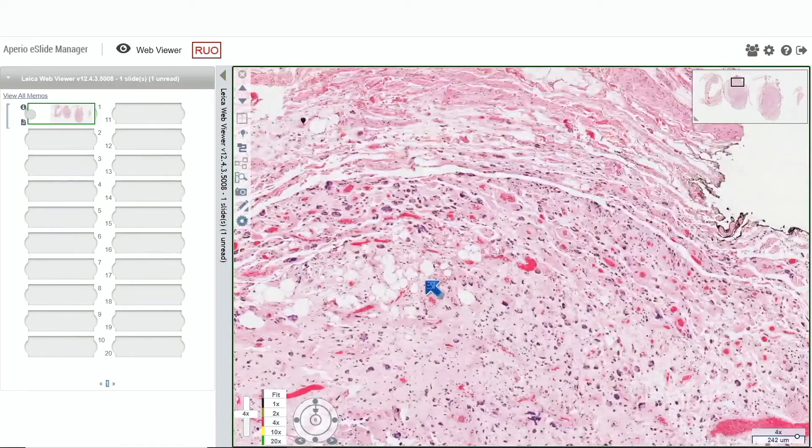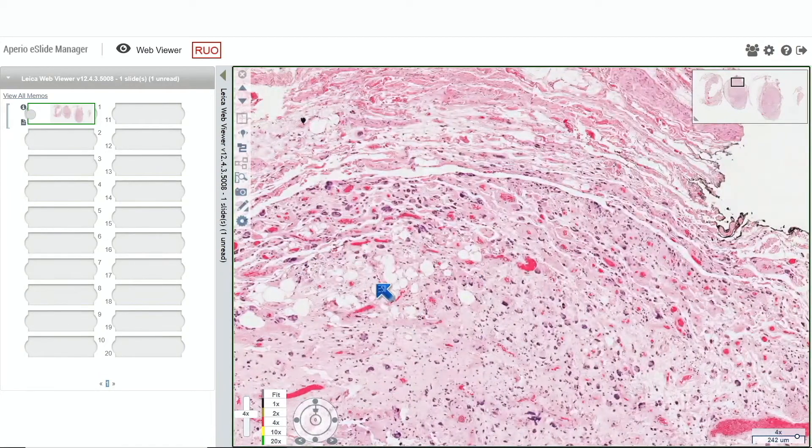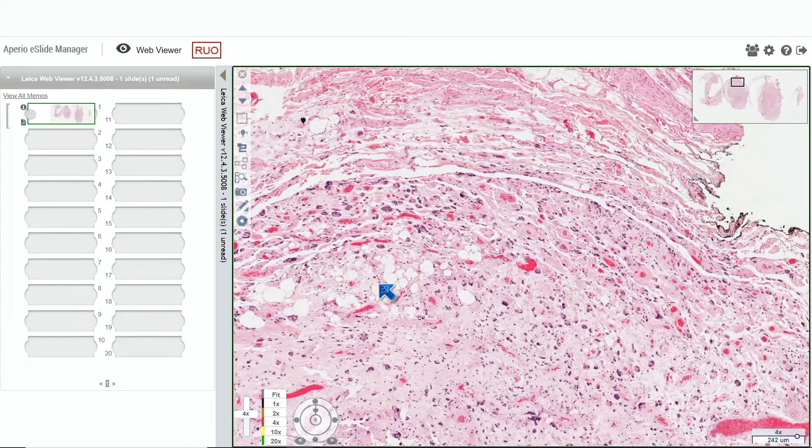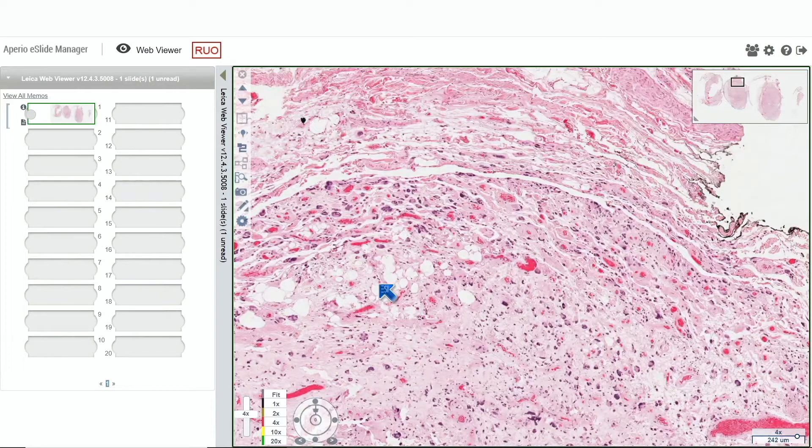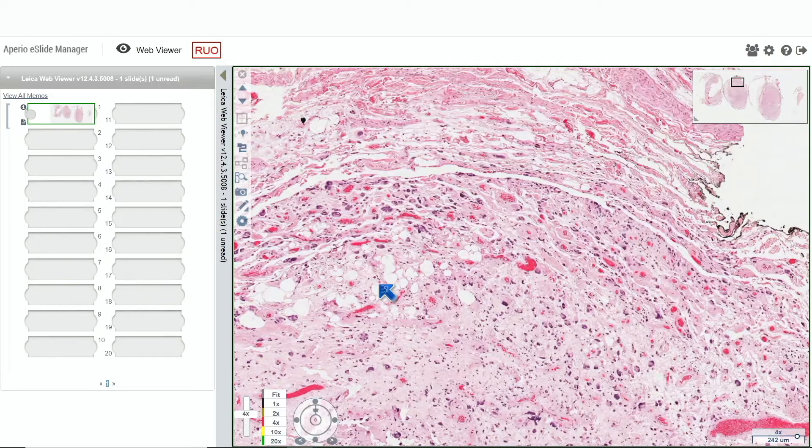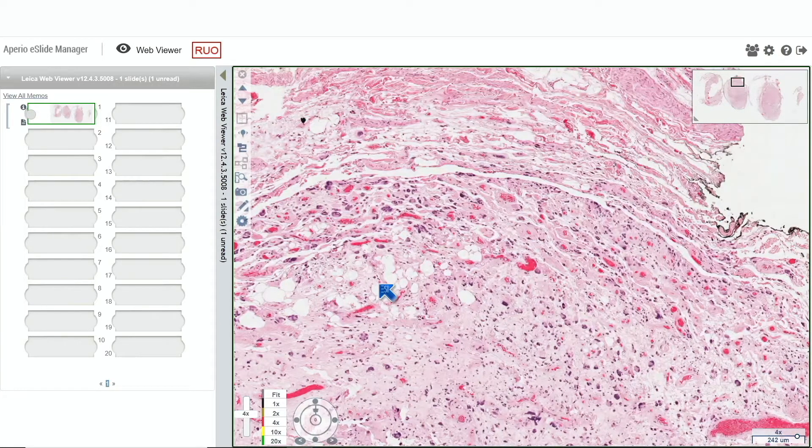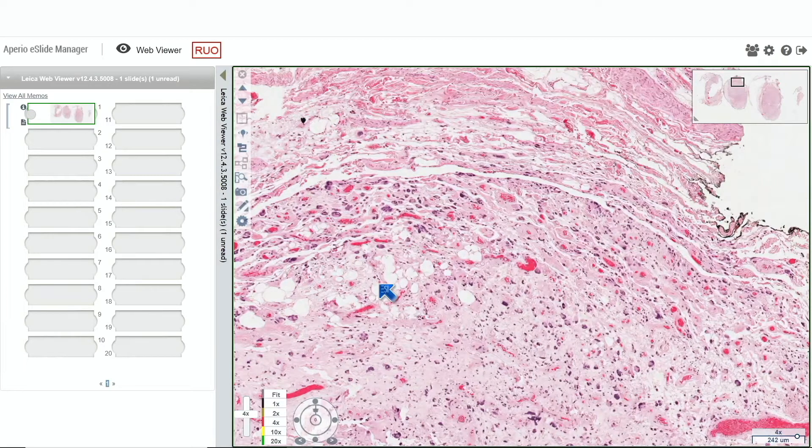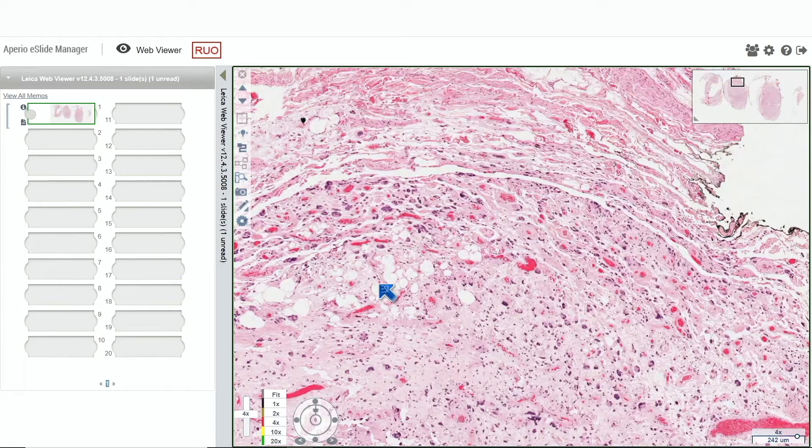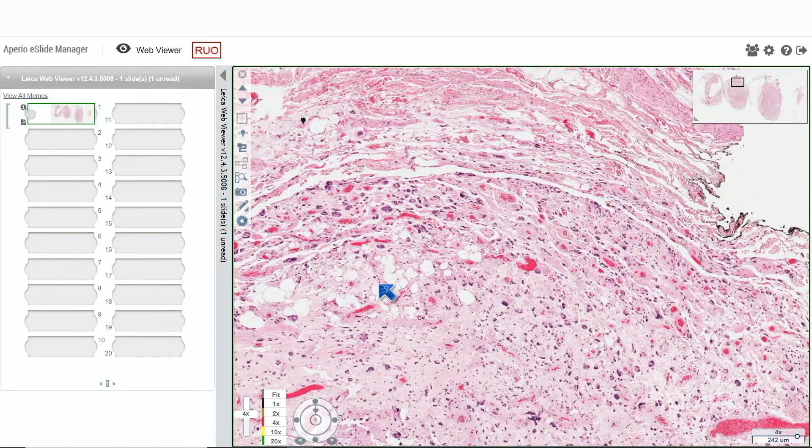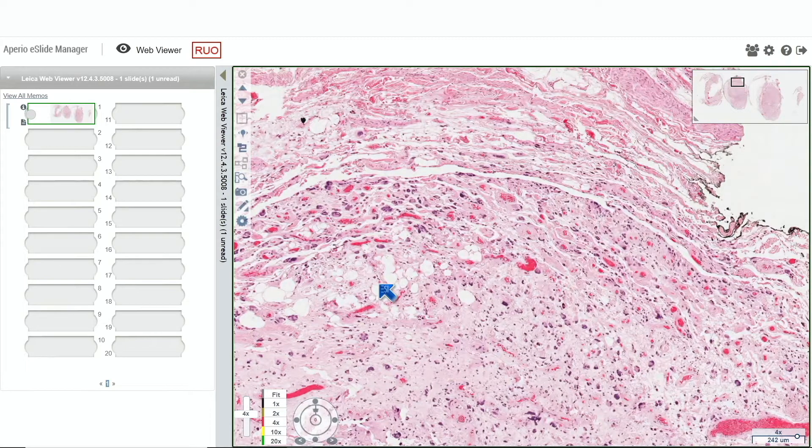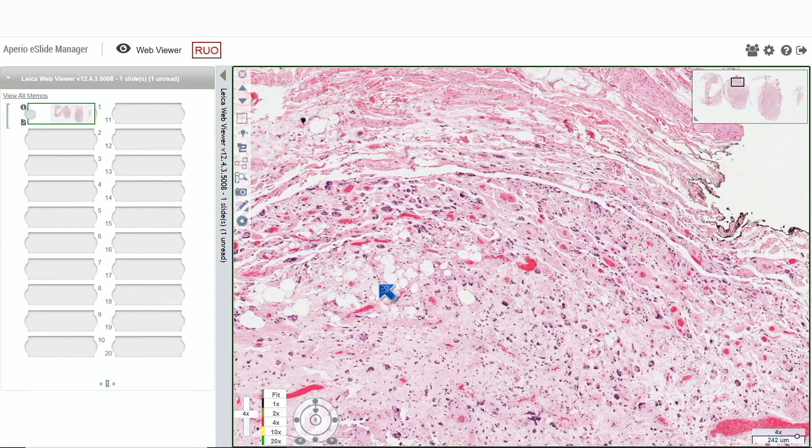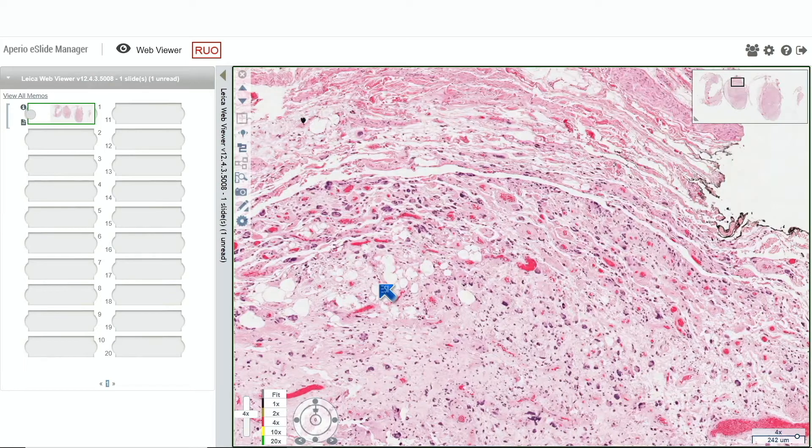Here's a little bit of fat. I've had cases sent to me of pleomorphic or spindle cell lipoma with no fat, and I make that diagnosis. Then the person who sent me the case calls me up and says, "You call this a lipoma and there's no fat." I just say, well, this is an example of a fat-free pleomorphic lipoma or a fat-free spindle cell lipoma.